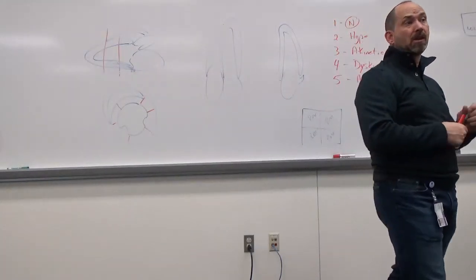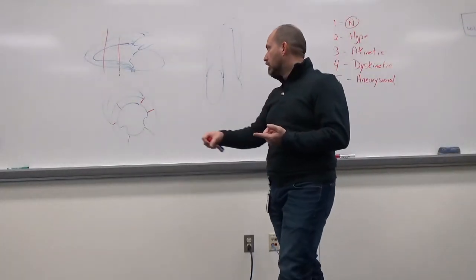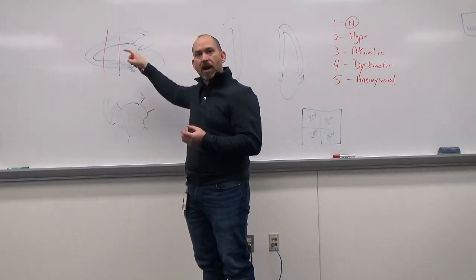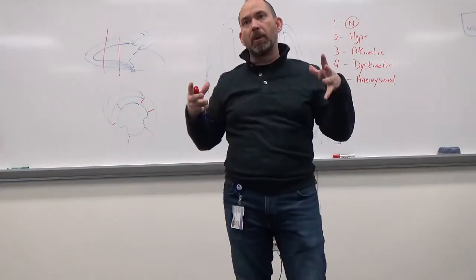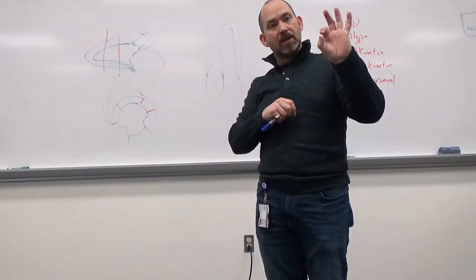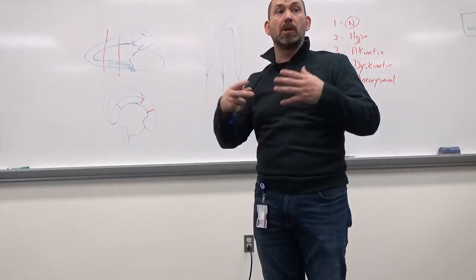So if I'm looking to see how stenotic an aortic valve is, and if it's relative to cardiac output, say for example somebody's got a very low cardiac output and they've got a valve that's kind of borderline, moderate to severe, and I'm trying to determine where that is, I might do the stress test to put more load on the heart to see if the velocities increase, or if they had a low cardiac output, maybe there just wasn't enough blood to really push it.